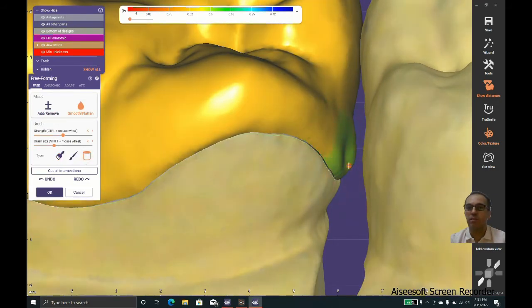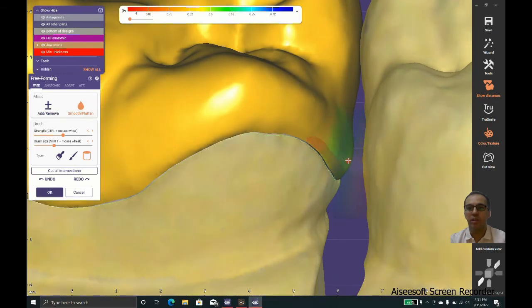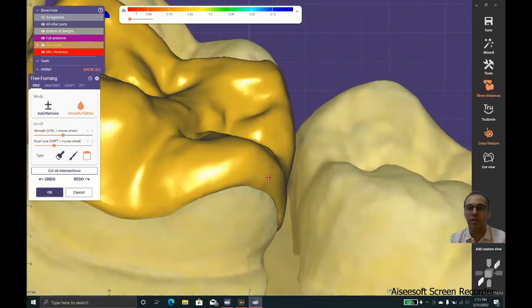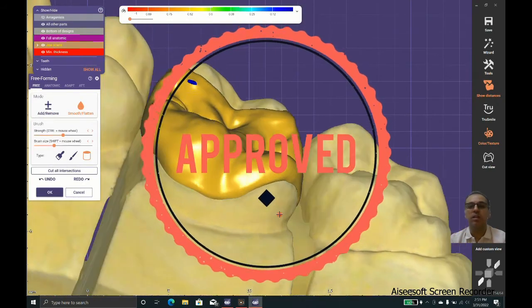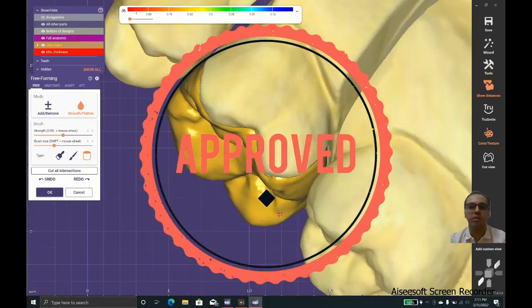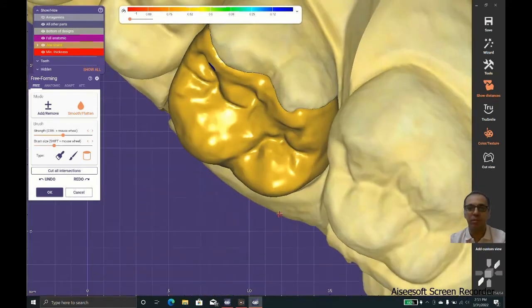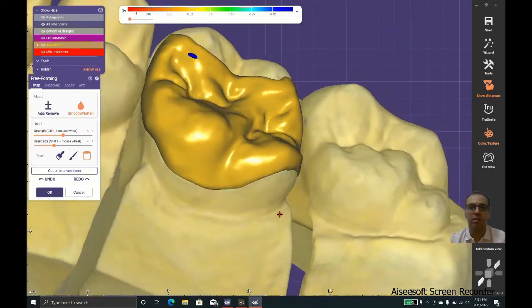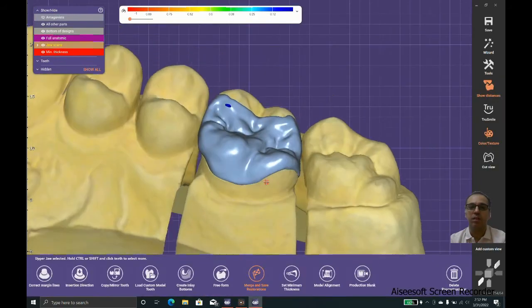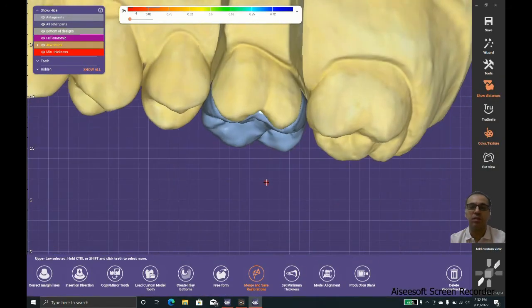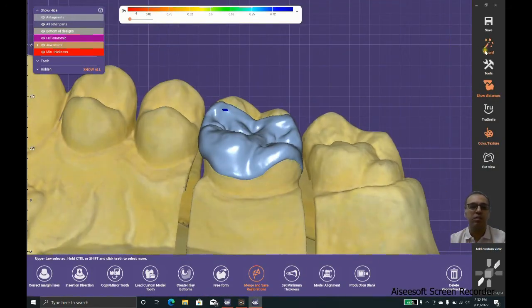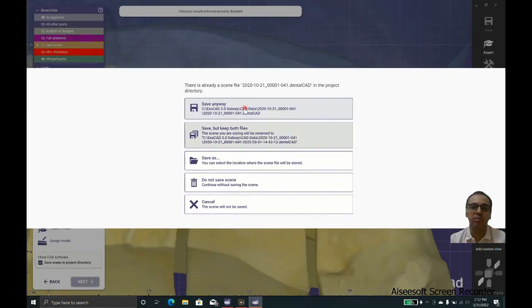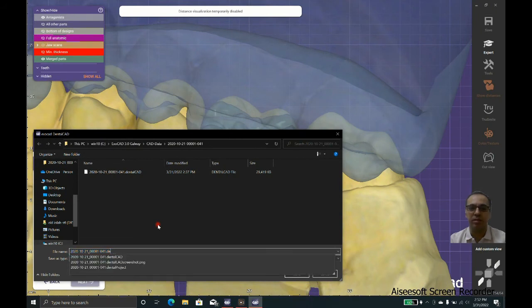Now we have a proper emergence profile. This is perfect. Now you can be sure that this restoration will last long for the patient. Thank you everyone. I hope you enjoyed this lesson and I hope you make good restorations always. Bye for now.